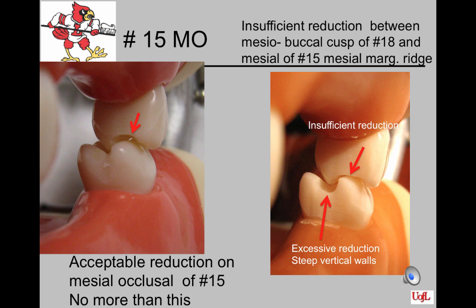The rest is approximately 1/2 the width from cusp tip to cusp tip. It may have sluice ways if buccal and lingual arms are on the tooth. The purpose of these sluice ways is to create room for the metal arms to be present and not enlarge the size of the tooth.